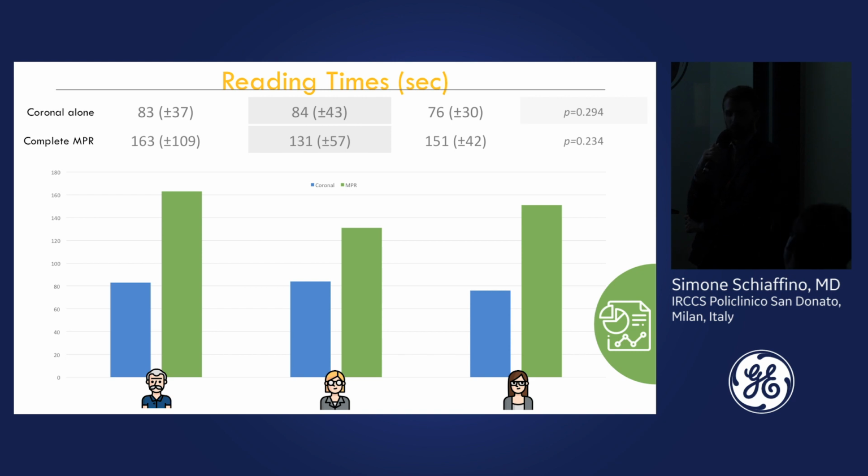Yes, and only the reading, not writing the report. The report depends on how fast you are at writing, whether you use the automatic report from the workstation or another software, so this is variable, depending on your experience and your daily clinical practice. Thank you for your question.